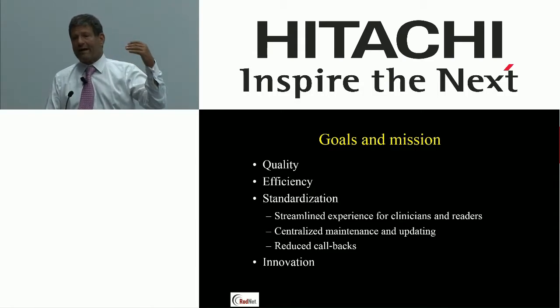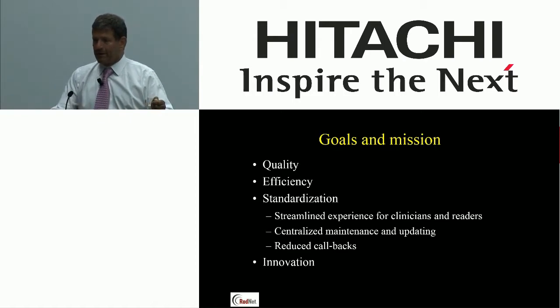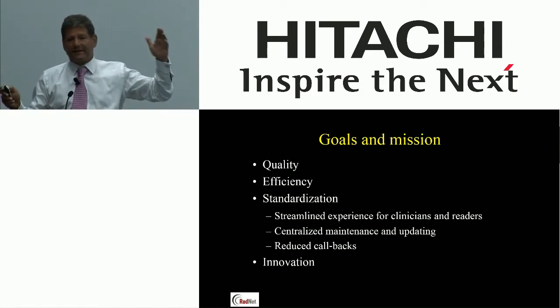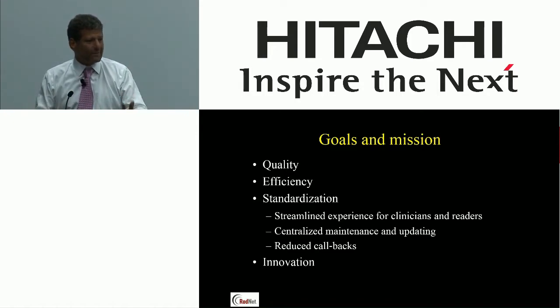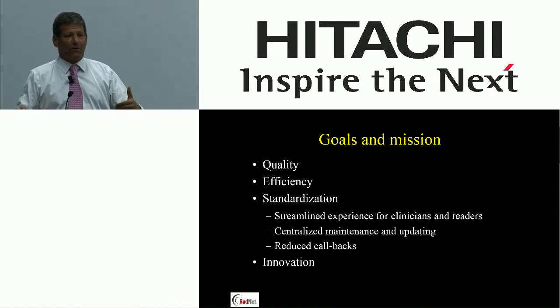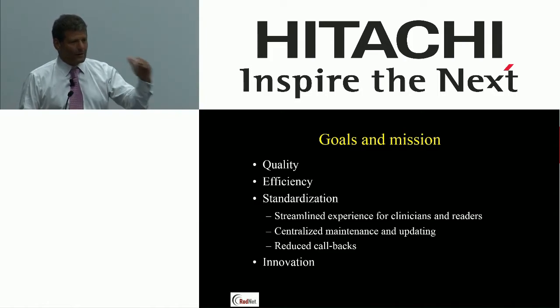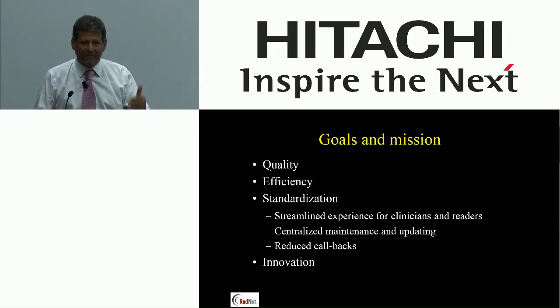You know, the radiologists who are being pressed to read more and more exams every day really struggle when they've got a big preamble. Where's my T2? Where's my T1? Why isn't this facility doing what they're supposed to be doing? When they come up in the same way, with the same names across your organization, we're 80% of the private practice of New York, okay, RadNet is. 80% of the private practice in New York City. All of those exams are done the same way. Same names, hopefully the same order. It makes everything more appealing.